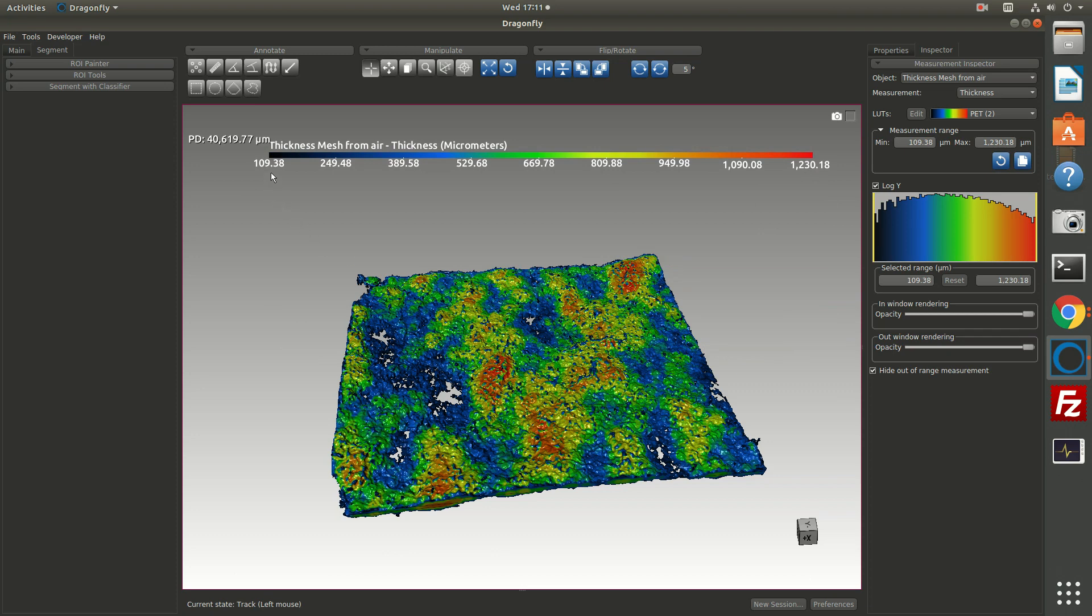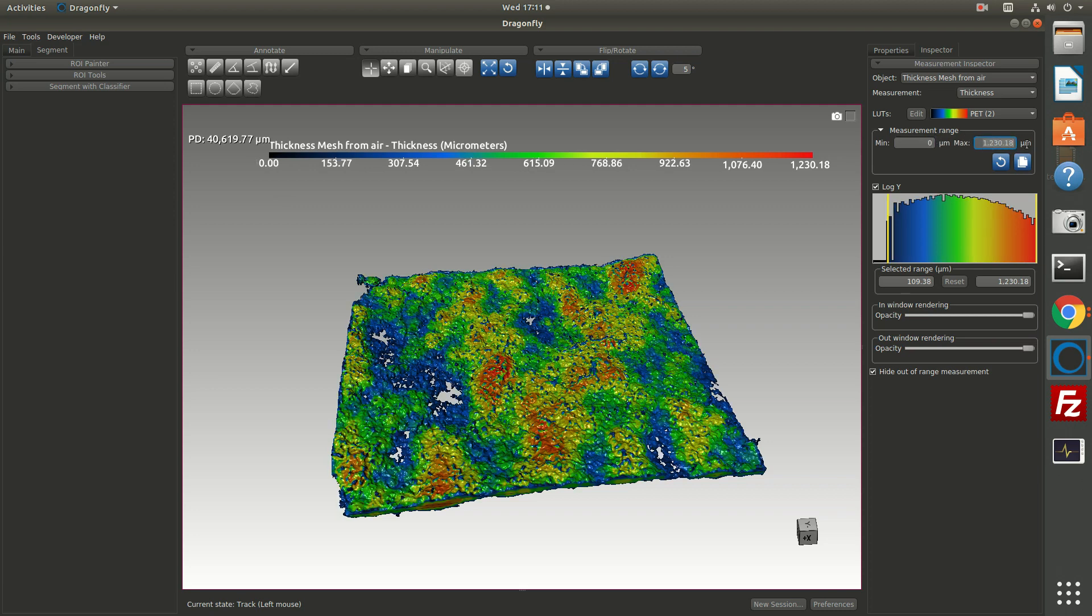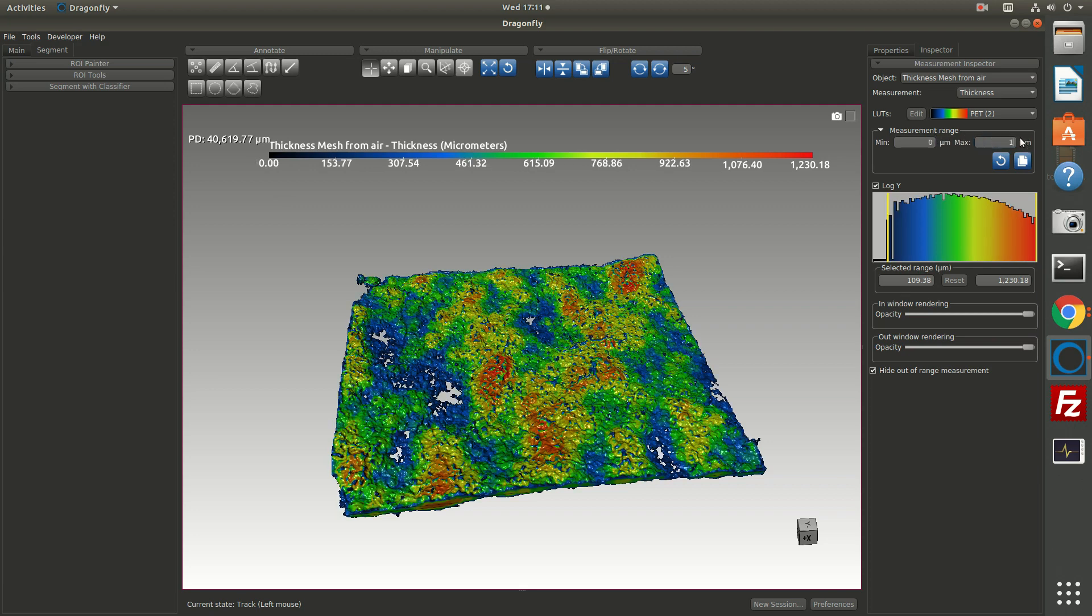If I'm creating a number of figures and I want everything to be on the same scale, that is, I want my scale bar—in this case, it goes from 109 to 1230, because those are the thicknesses on this fracture. But the next data set may go from 50 to 1500. So if you want to create a universal scale, I can set that here. I can say I want it to go from 0 to, let's say, 1300. Now my scale bar is mapped from 0 to 1300.